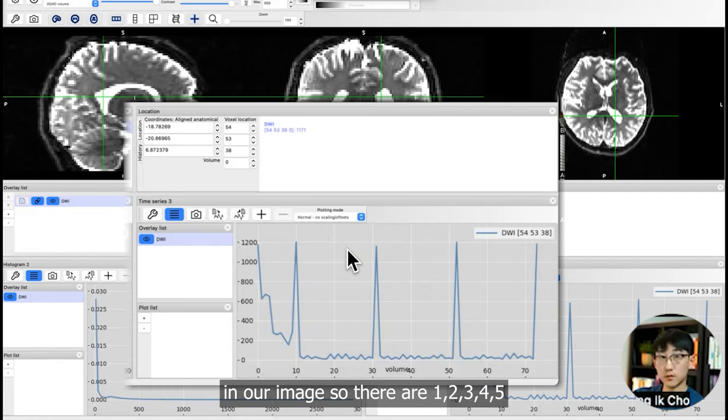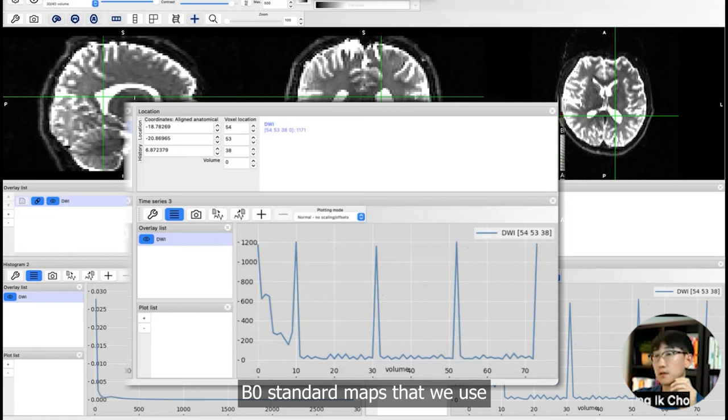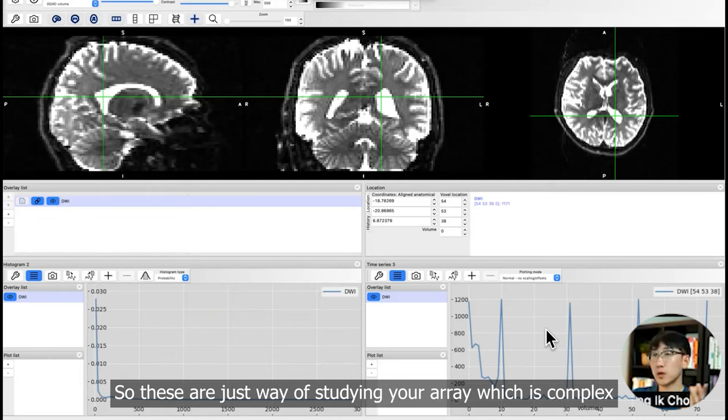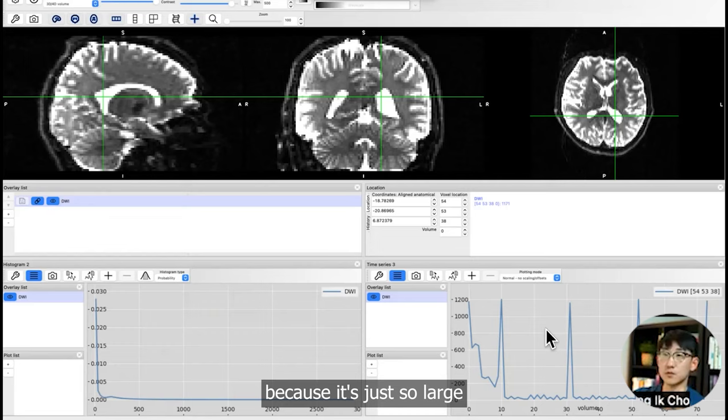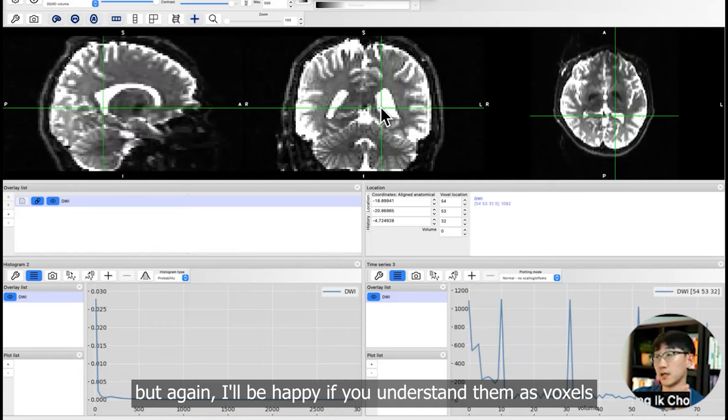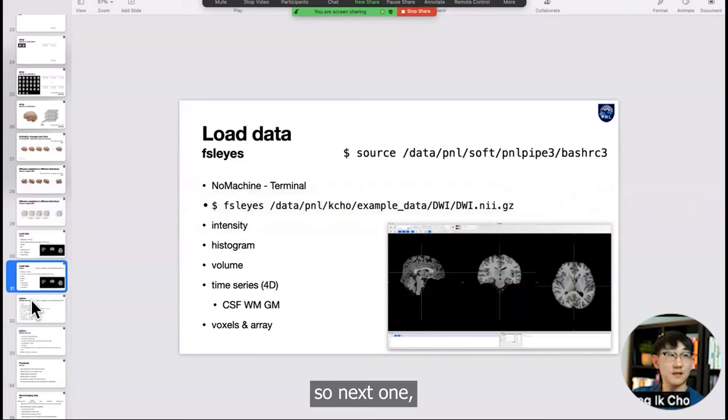From this time series map, we can infer how many B0 maps, the standard map that we want to compare the diffusion weighted volumes to. There are one, two, three, four, five B0 standard maps that we use to compare each volume to calculate the diffusion. These are just ways of studying your array, which is complex because it's just so large. But there are tools like this. Again, I'll be happy if you understand them as voxels.